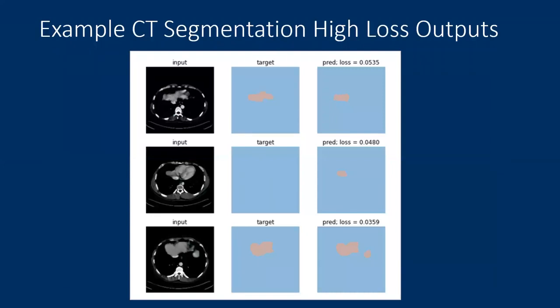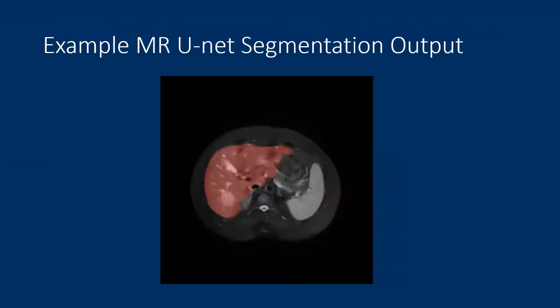We also stress within the tutorial series the importance of reviewing cases manually, which have high loss function values. So essentially, these high loss function value cases are the worst predictions the model is making. These types of cases can be really important for understanding potentially clinically concerning errors that the model is making, or for understanding if there might be fundamental issues with the labeled training data or the ways that the model is processing the data. Here's another example prediction for an axial MRI slice, which shows that the segmentation is a reasonable rough approximation, but definitely not perfect if we look at it with much scrutiny at a pixel-specific level.